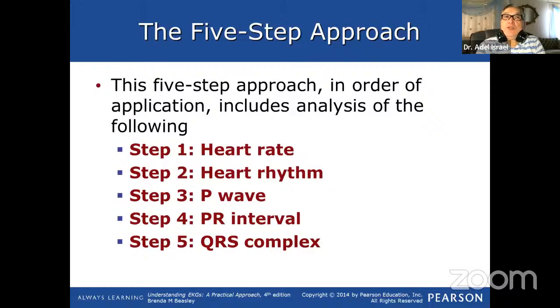Like I told you, all the new machines provide you with this information about the number and regularity, but in the certification exam, they give you the strip, and we are going to practice by the end of this lecture how to answer these 5 questions or 5 steps. According to this, we can reach the analysis to the maximum, and we are going to be professional.